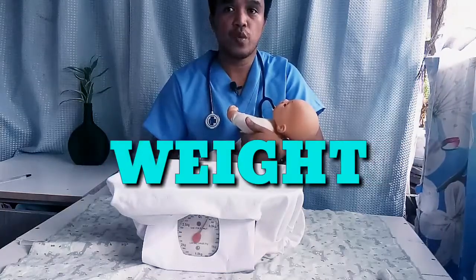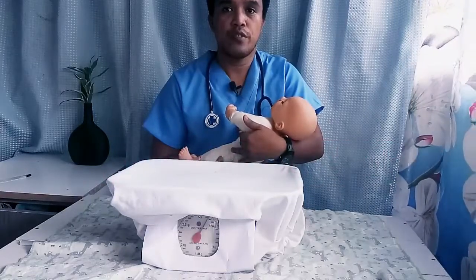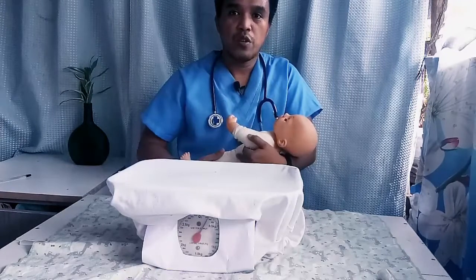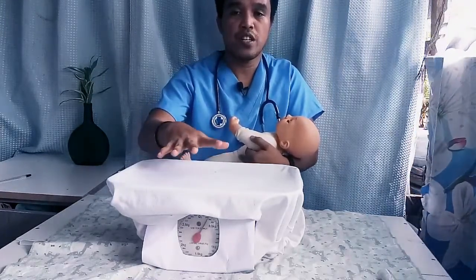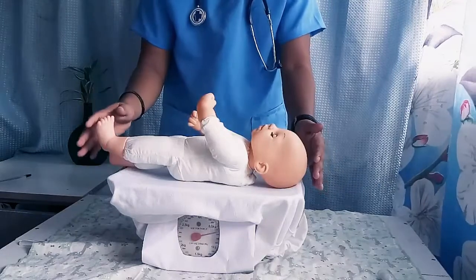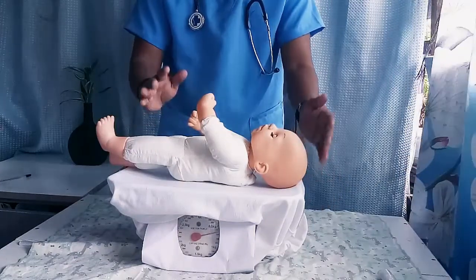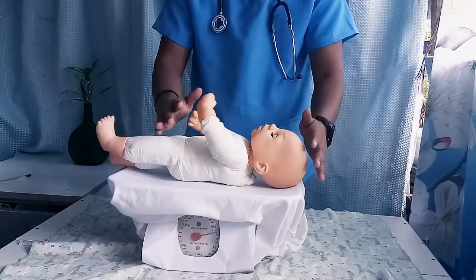To obtain the infant's weight, we remove the infant's clothing and soiled diaper, though a dry diaper can be left on. Now we will weigh the baby. Place the infant on the scale and obtain the weight. The infant weight is 10 pounds and 2 ounces. We will document it.